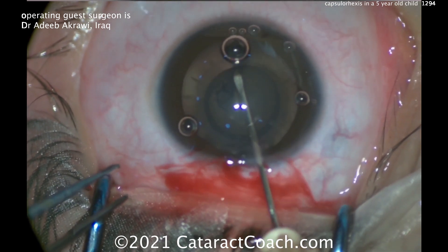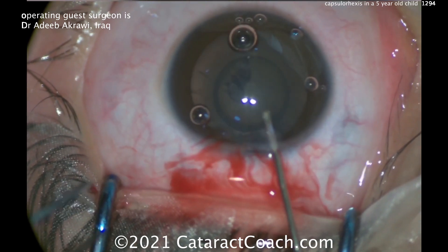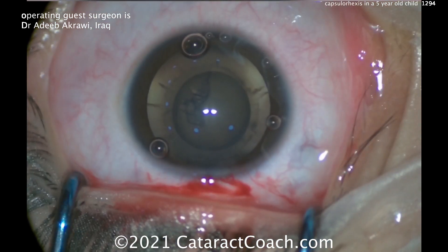I was very impressed — he had a beautiful, literally perfect 5mm capsule rexis for this young child.